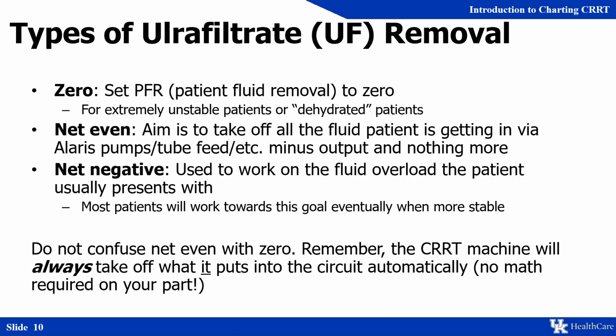They are often confused. The machine will never allow you to give your patient a bolus through the machine, right? Because you wouldn't want to give your patient a bolus of Prismasol, for example. However, it does not know what the Alaris pumps and the Kangaroo pumps and all the other things are putting into your patient.